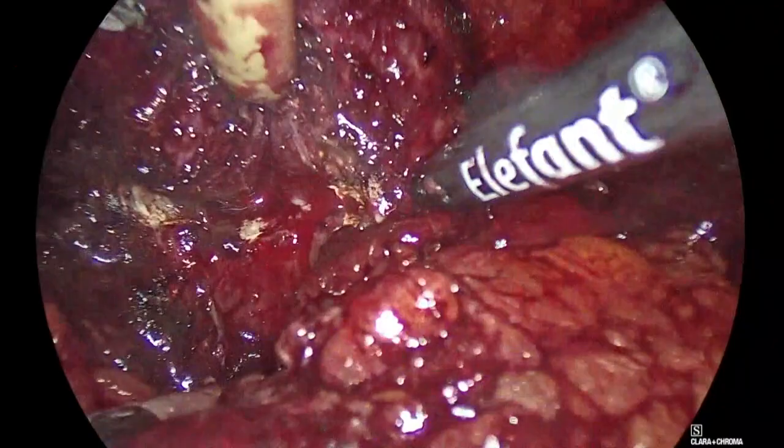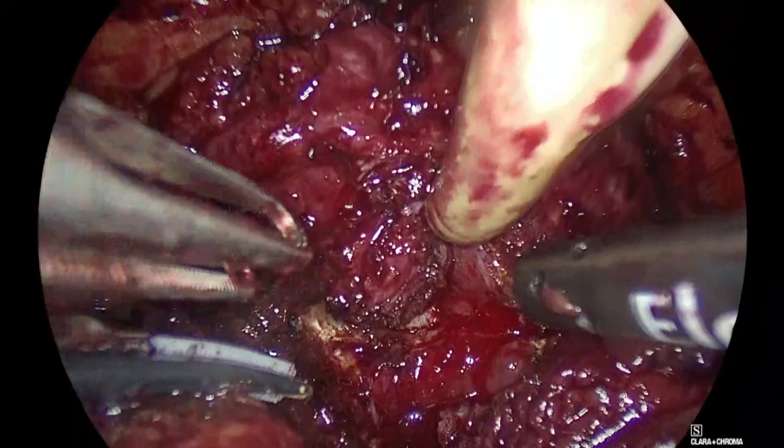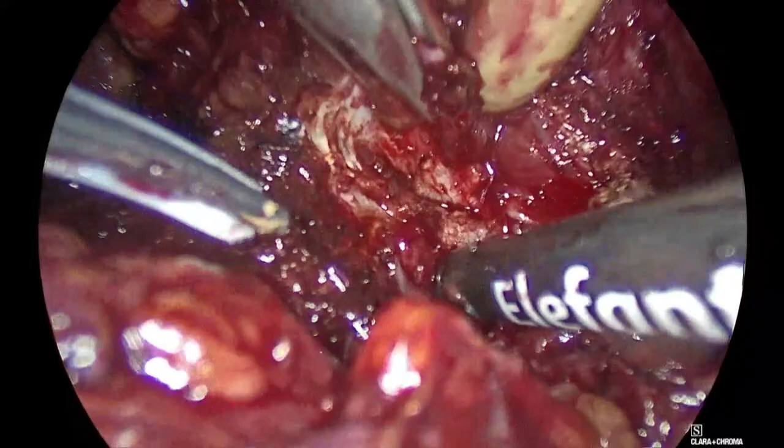Please tell us, is someone taking the catheter or is it an automatic holding by the assistant, a stitch or something? The catheter is being held by the assistant. Okay. So now my next move sometimes is... Sometimes it can be helpful to use a stitch. I'm grasping the prostate. I'm pulling the prostate out.